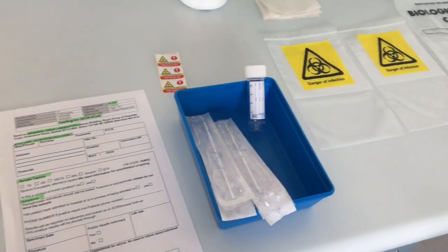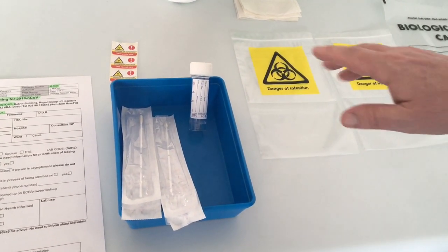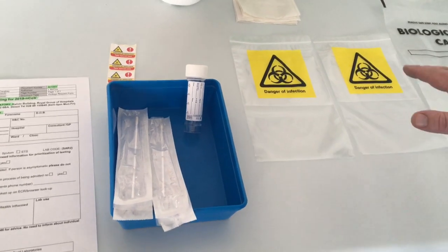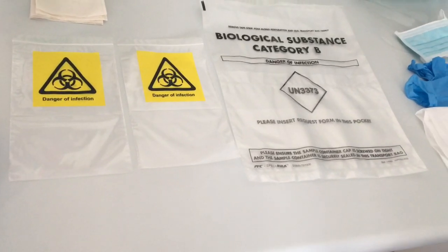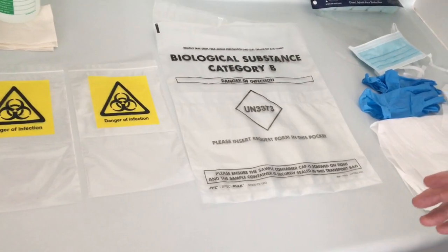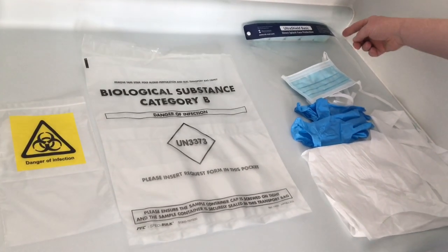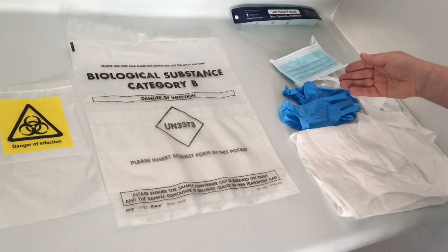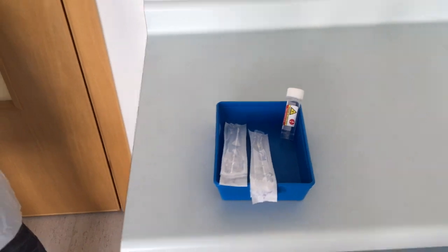Other things you're going to need outside the room are the bags that the sample goes into — we've got three different bags and we'll show you how to do that later. Of course, the other thing you need before you go in to see the patient is your personal protective equipment, or PPE. For taking a sample, we use a fluid shield mask with eye protection such as a visor, disposable gloves, and a disposable apron.